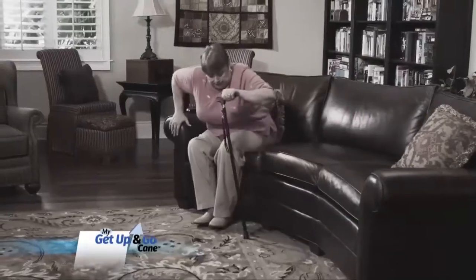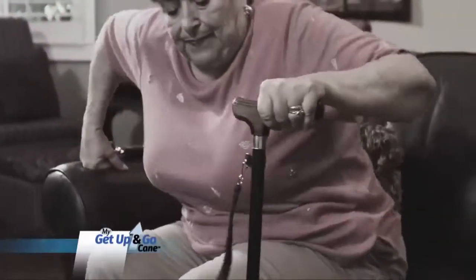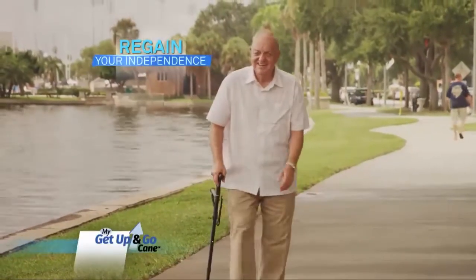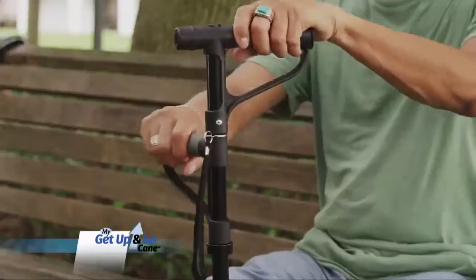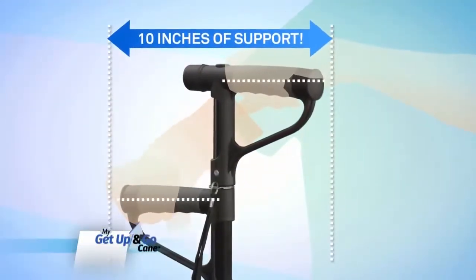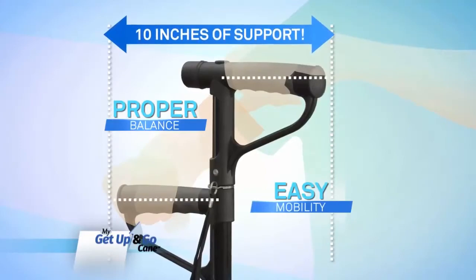Traditional canes can be wobbly and even unsafe to lean against, leaving you reluctantly asking for help. But with My Get Up and Go Cane, you'll regain your independence. The difference is in our equal weight distribution system, leveraging 10 full inches of support for proper balance and easy mobility.